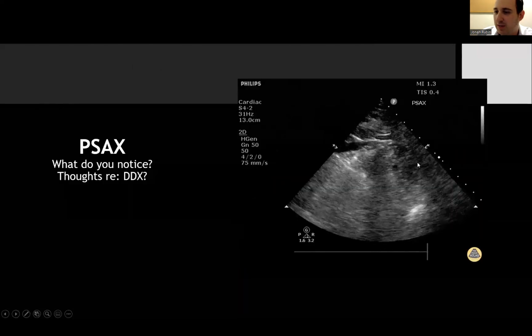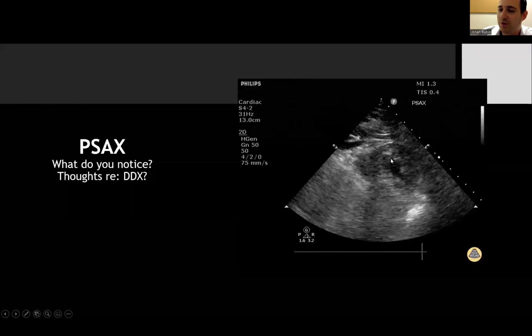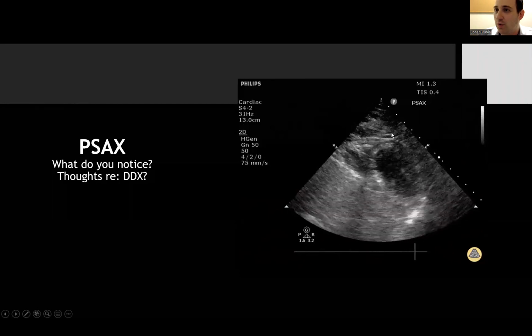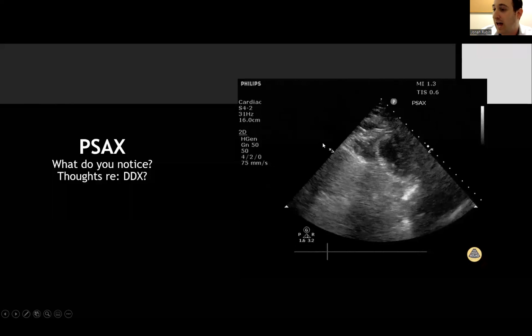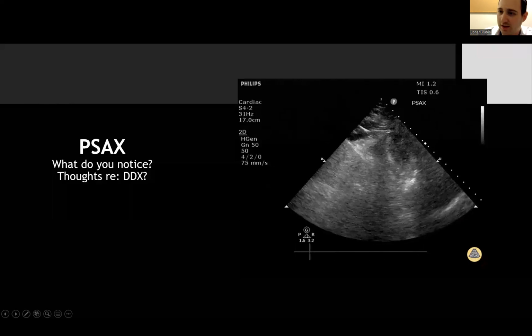And I think that's important to point out, because I'm not giving all the short axis views, and very often you won't get them, right? Sometimes this is all you'll get. And if you get just this clip, you could be inclined to say, okay, this patient's got normal LV function, let's move on, and not realize that, no, that's not true. If you were able to get the higher level views, you would realize that this patient actually perhaps has diminished LV systolic function.